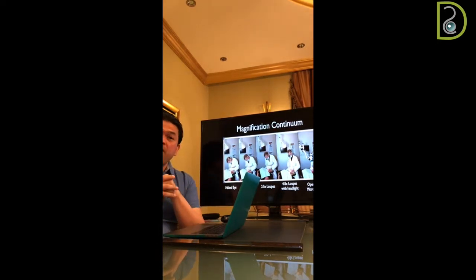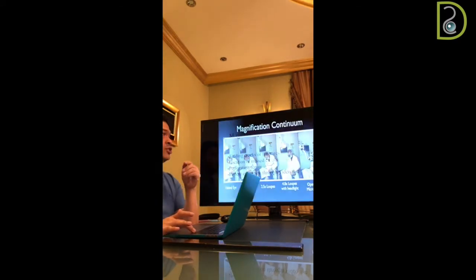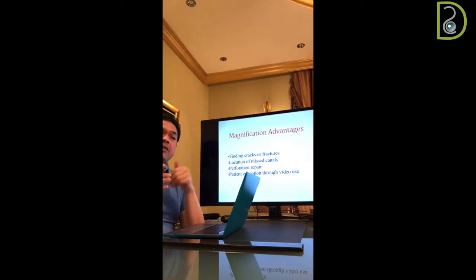Why do we have to use magnification? Actually, we have many advantages of magnification. You can find cracks, you can find fractures, even we can find a missing canal. If you have a perforation there, you can find it easily.